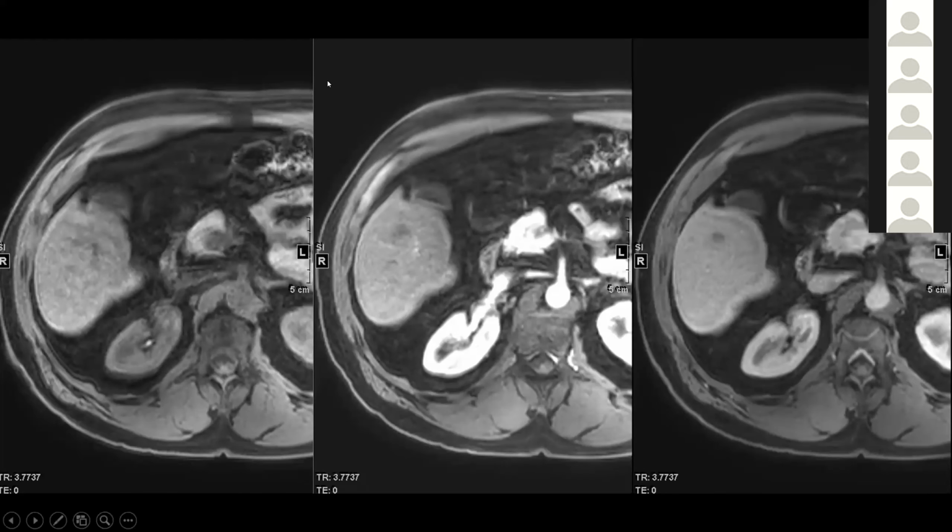Yes. So in that respect, in ultimate truth, if you have this curve, it's washout, because the lesion enhanced a little bit and then lost it, just contrast left. The question is that if all of that curve is below the liver, it's difficult. So this is the conversation: can we provide guidance for the reconstruction of this curve under the curve of the liver? It's still under debate.